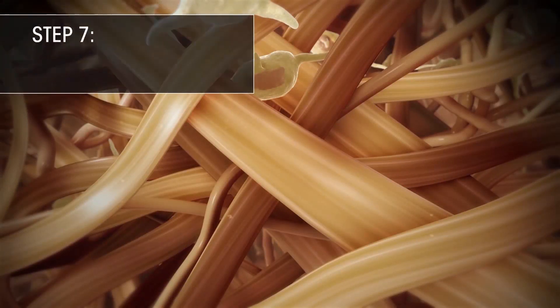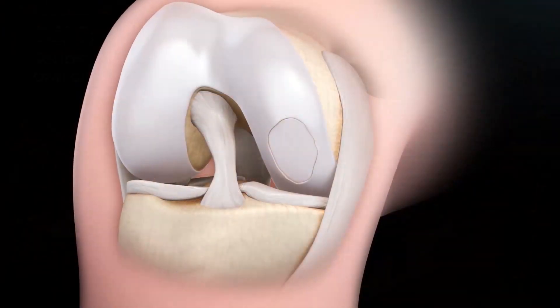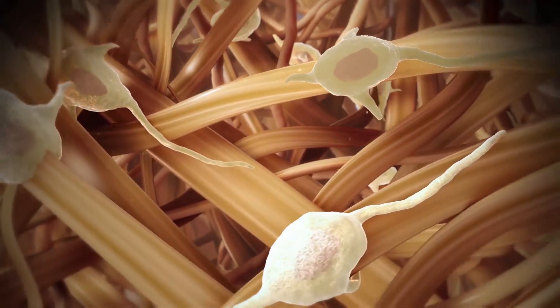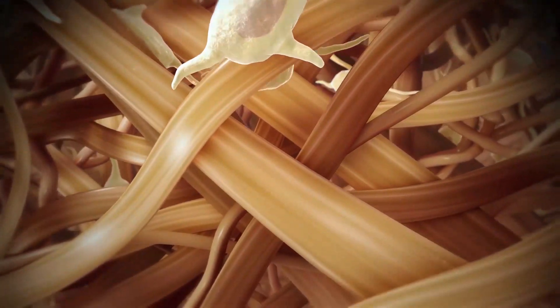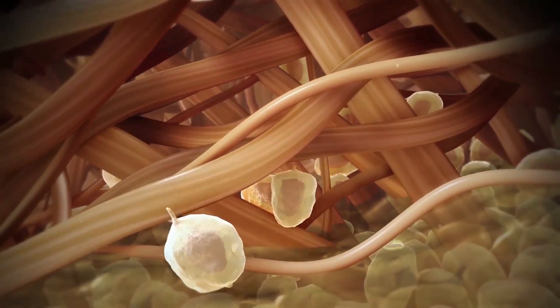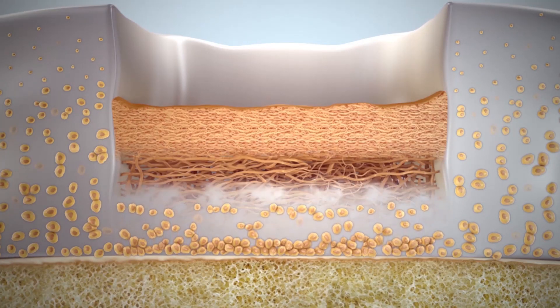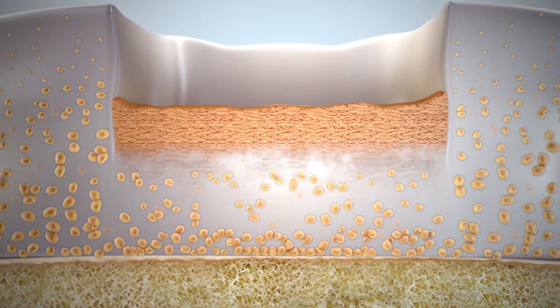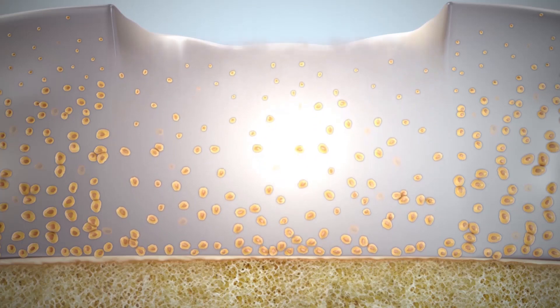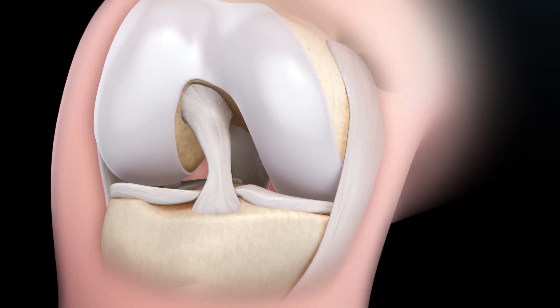Step 7: Restore With Your Patient's Own Cells. Cellular restoration occurs in several stages. A few days after treatment, the chondrocytes migrate from the cell-seeded surface of the implant into the fibrin. Over the next several months, these cells begin to synthesize matrix proteins consistent with native cartilage, including type 2 collagen, aggrecan, and other matrix proteins. Over the course of a year, the matrix continues to expand to fill the defect, and reaches full maturity over the next 12 to 24 months.